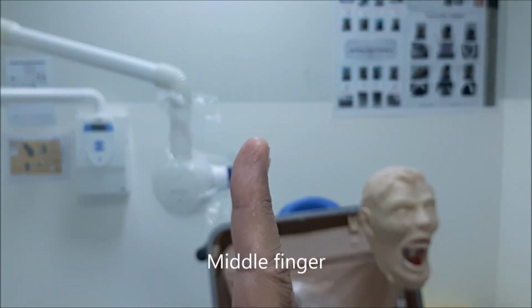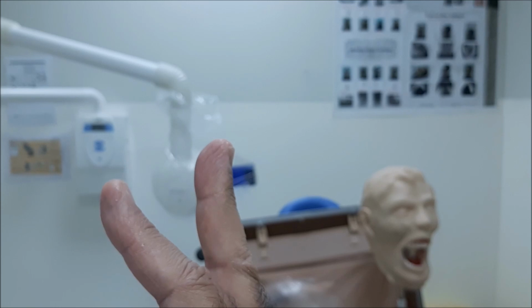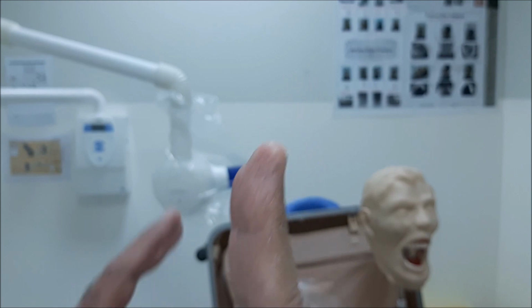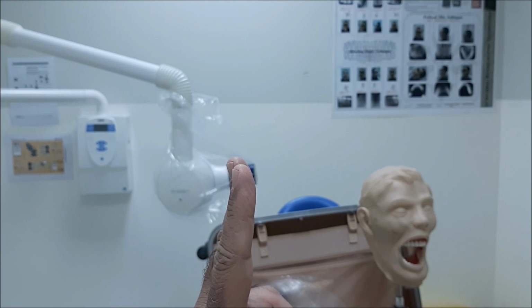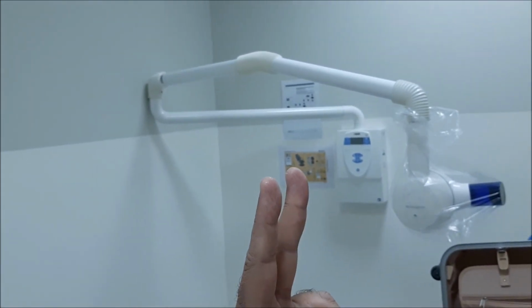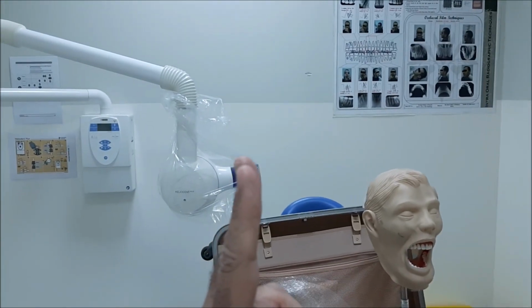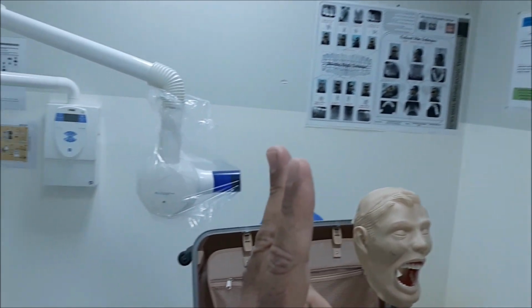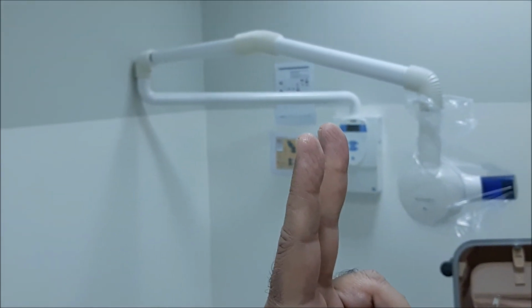What we're going to do is try to have a look at this one. I will shift the camera, as you will see now. This is the index finger covering the middle finger. What I will do is come from a side, and then from the other side. I'm not moving my fingers. What I'm doing is just moving the camera.